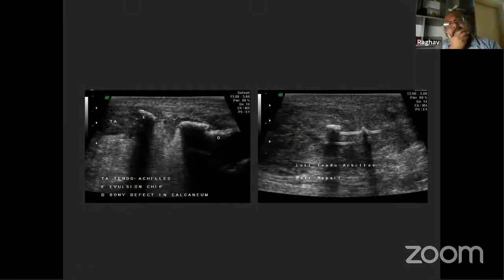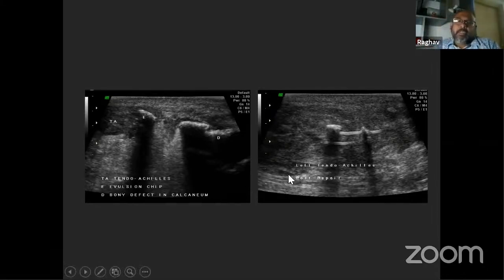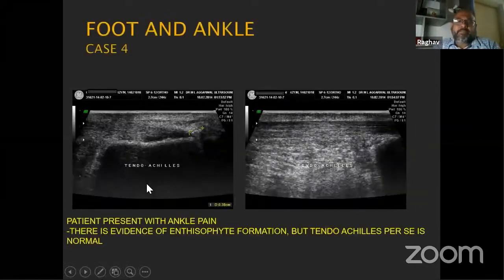And adding one more point, as Dr. Daftari said, that we as radiologists have to learn to be clinical radiologists, and we have to answer the clinical question which the orthopedic surgeon has asked. So if my clinical question is that there is an instability and I'm going to answer it on the ultrasound, the choice should be the ultrasound first and then the MR. Or if the MR has been done and we want additional information, the ultrasound could be the modality of choice.